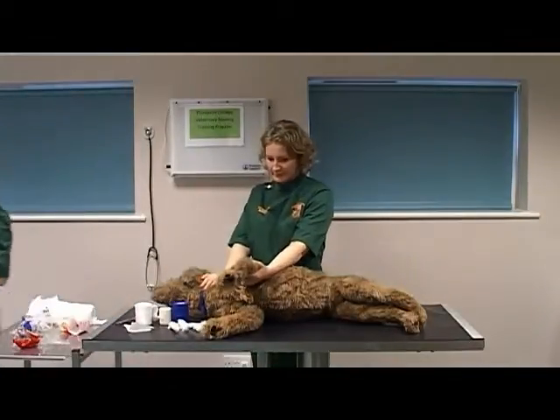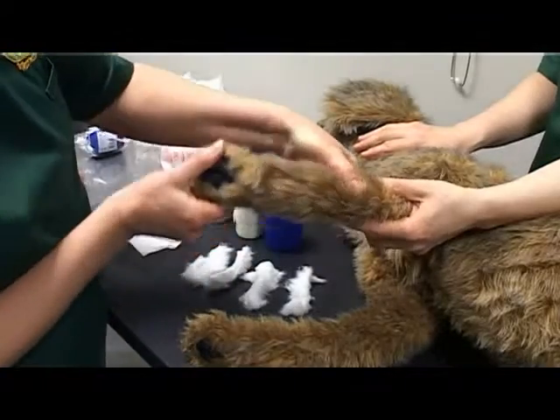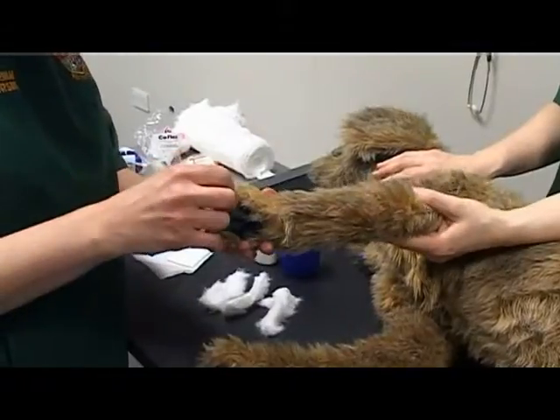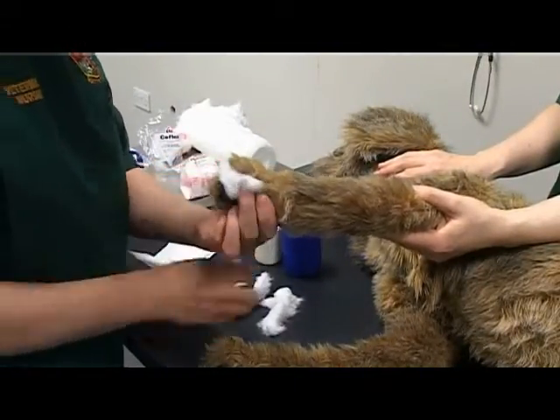Place the patient in lateral recumbency with the affected limb uppermost. Ask your assistant to support the affected limb to facilitate bandaging. Apply padding between the toes as far as possible on your model.